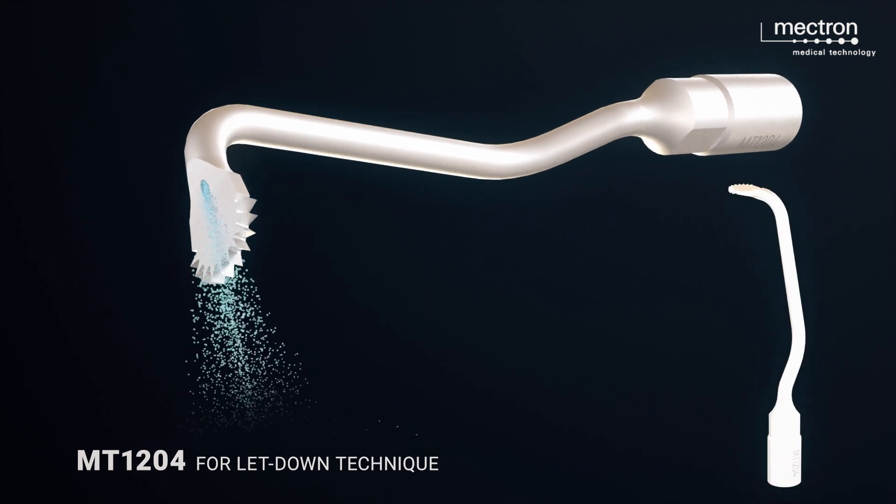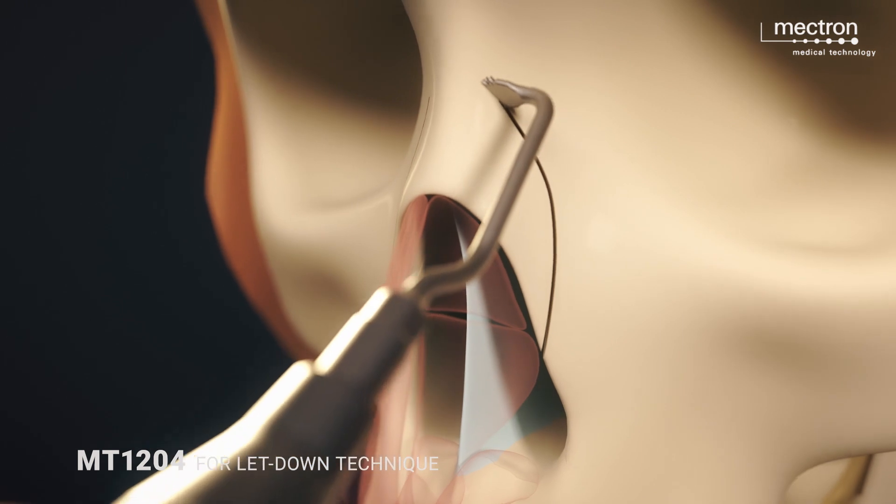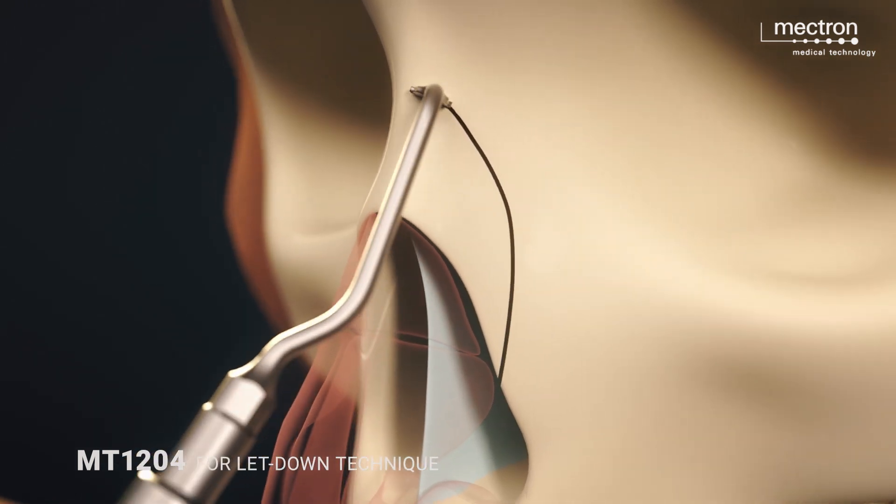MT1204 is suitable when the lateral osteotomies are to be connected to one another by a transverse osteotomy at the level of the nasal radix, for a let down or push down procedure.